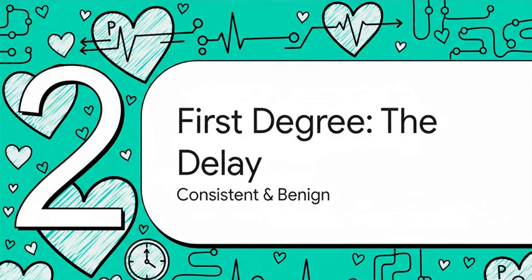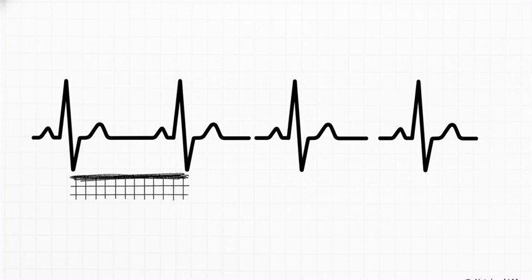All right, let's kick things off with the simplest one: first degree AV block. Honestly, this one is less of a block and more of a consistent, predictable little delay. So the big thing you're looking for on the ECG here is a prolonged PR interval. That means it's longer than 0.20 seconds, which, as you know, is 5 of those tiny little boxes on the ECG paper. But here's the absolute key: it's consistently long.